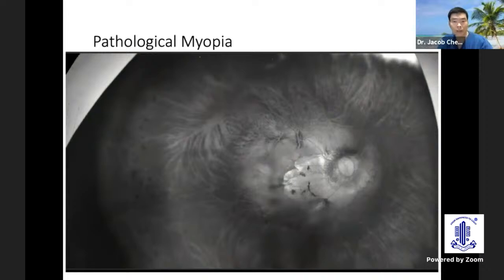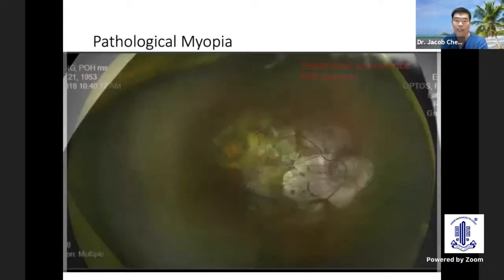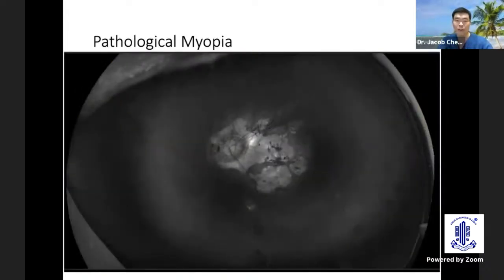Choroidal thinning on the red channel, as well as the baring of the sclera, and thin vessels and retinal atrophy on the green channel. Again, in the opposite eye, a typical pathological myopic fundus with peripheral changes, macular changes, as well as disc changes, choroidal atrophy and retinal atrophy.